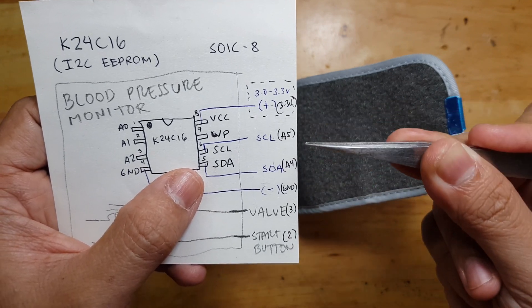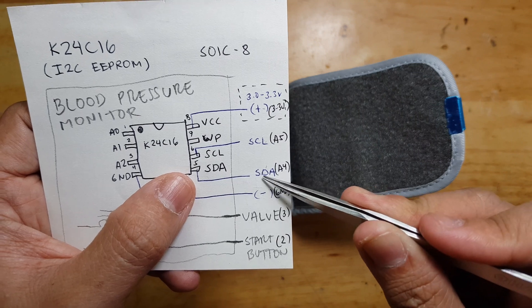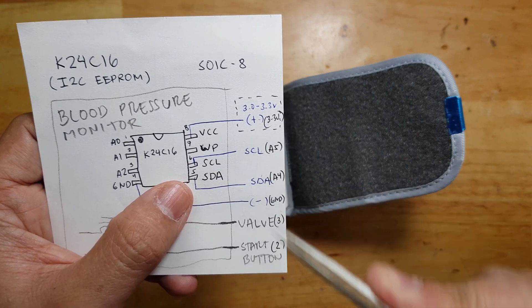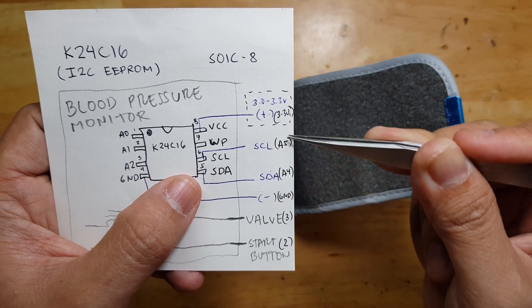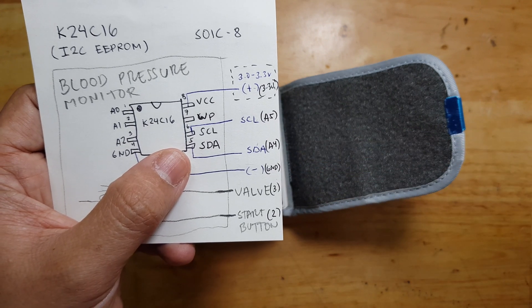The I2C pins are fixed: negative will be on ground, A4 will be on SDA, A5 will be SCL, and of course 3.3V will be on the 3.3V rail. If you use a different board this might differ, but for an Arduino Uno that's A5 and A4 for the I2C bus.